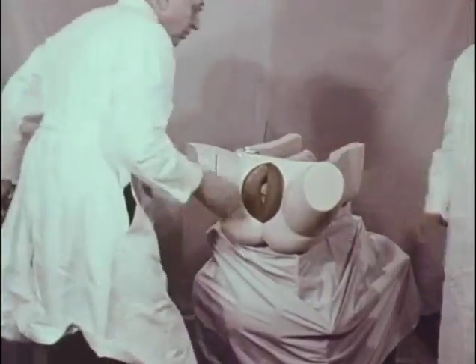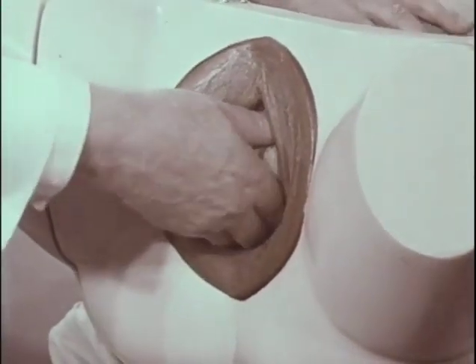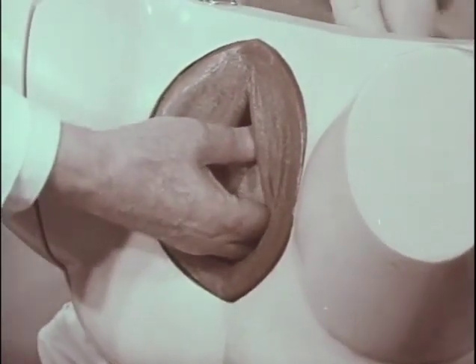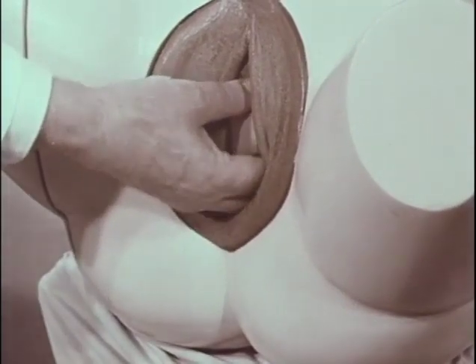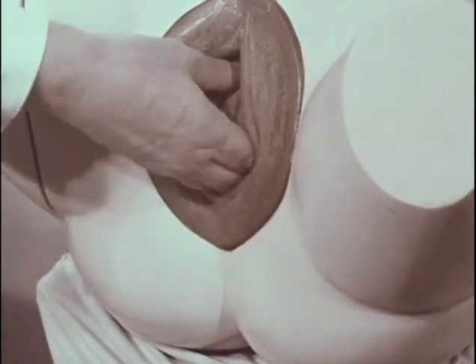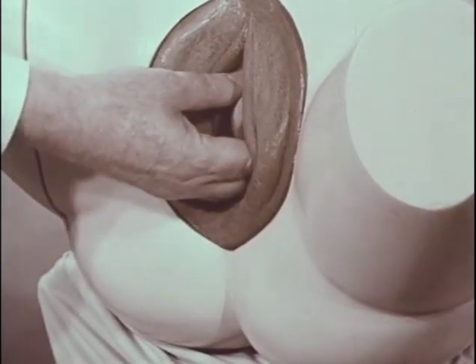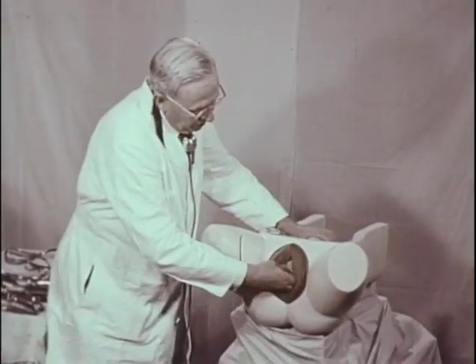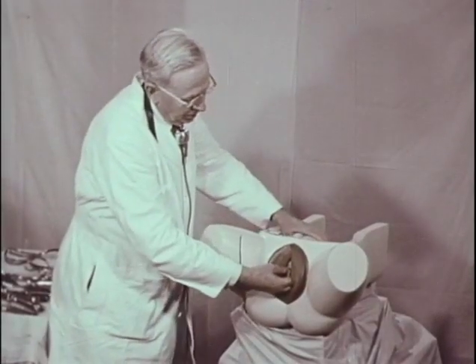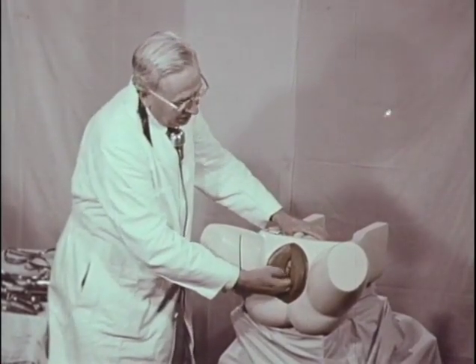With the manual maneuver, again we have the hazard of displacement. However, it is accepted by some on the basis that the head which has been down to a certain level will return to it again without much effort. However, we feel that this is not always true, and when it does happen, it's apt to be in a less favorable position.